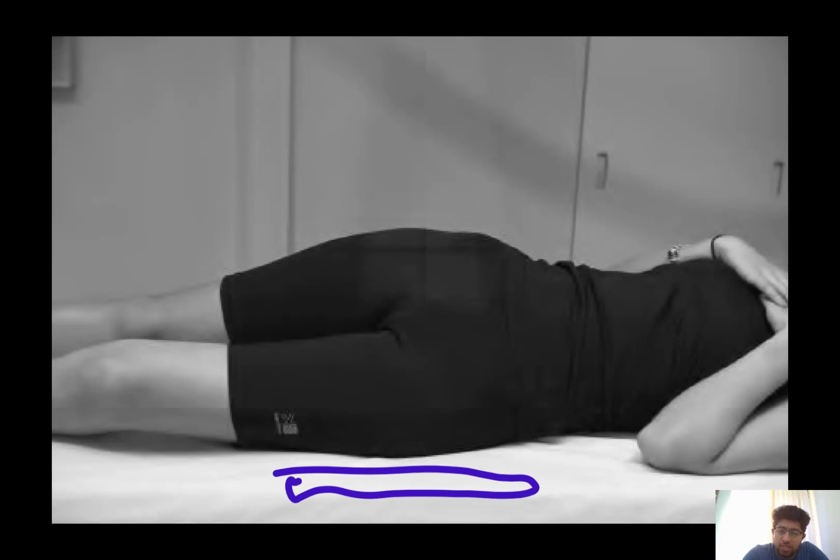and the imaging is done in such a way that the centering is done at the level of the femoral pulse, and the angulation of the X-ray is 12 degrees towards the foot end of the patient, and the imaging is done. This is called the reverse Judet's view. This is done if the normal Judet's view cannot be done because the patient is immobile or the patient is in pain.